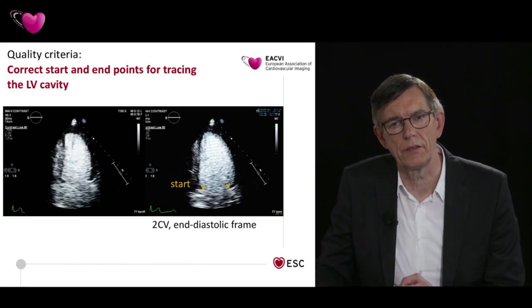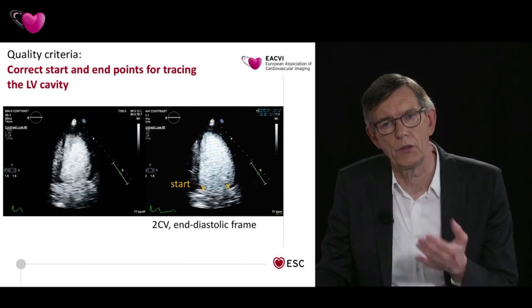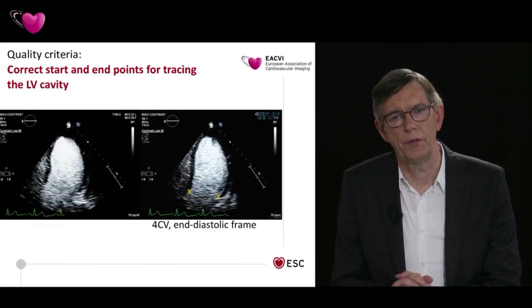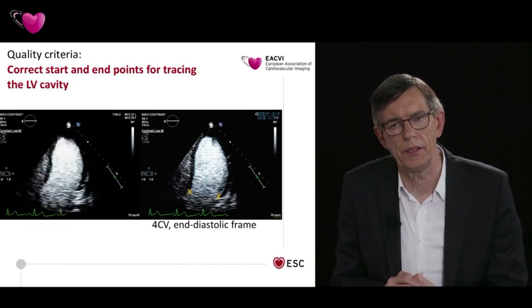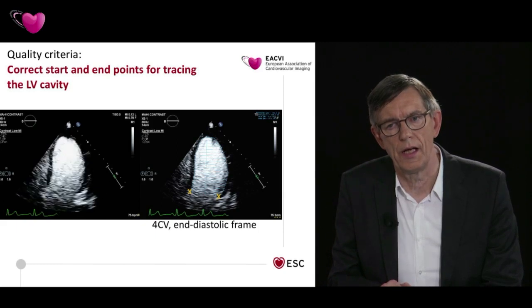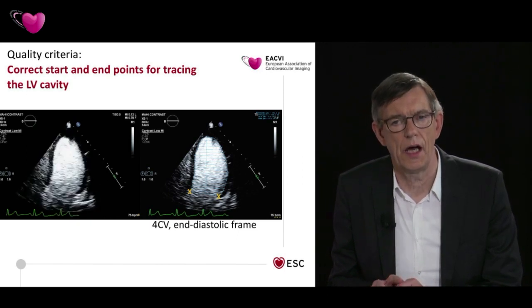And you can see also a little bit here at the anterior mitral ring, this bright echo Dr. Helfen mentioned in the previous talk. It may be a little bit more difficult in the four-chamber view. So in the four-chamber view, again, we can see where the myocardium ends, and there is no more myocardium, very well highlighted by the yellow cross on the lateral ring. So this is pretty easy, but on the septal side, it can be difficult, as we heard.